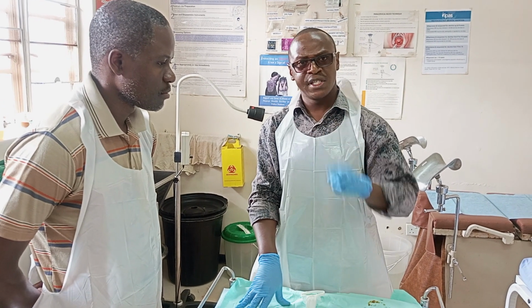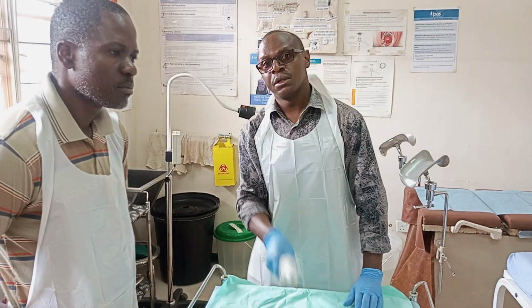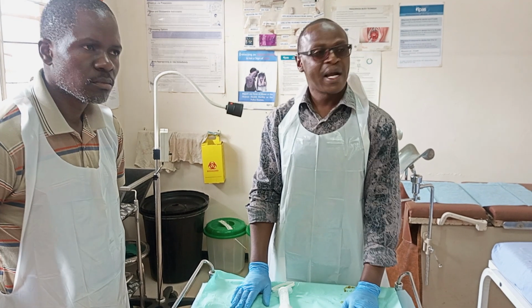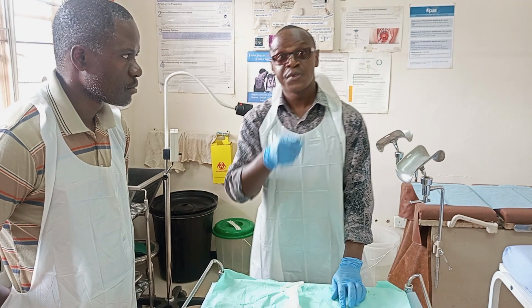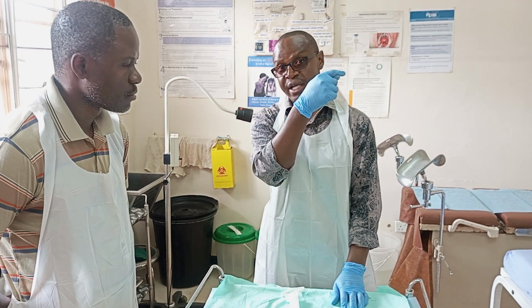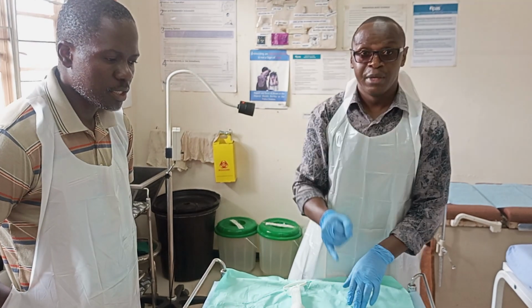With every surgical procedure, there are complications that are attached to it. One of the commonest complications of manual vacuum aspiration is bleeding. You will encounter a lot of bleeding depending on how you conduct this procedure. You see after finishing the procedure, bleeding will start coming out. It could be that something was provoked inside the uterine cavity where now bleeding is coming out profusely. So one of the complications is bleeding.